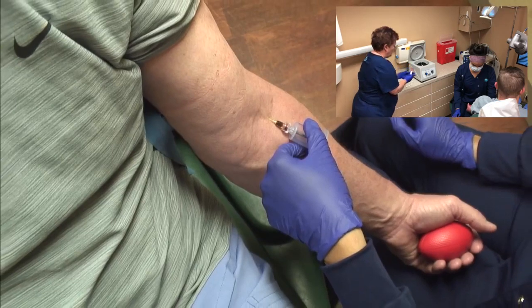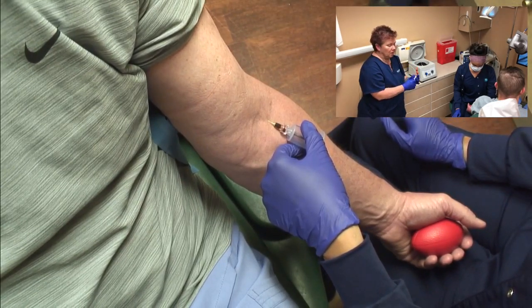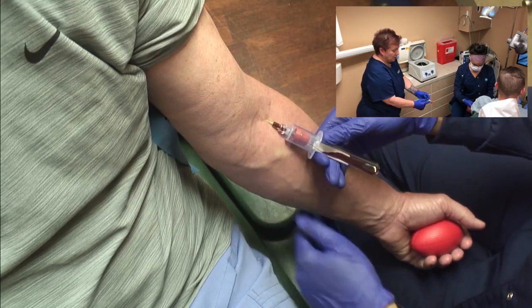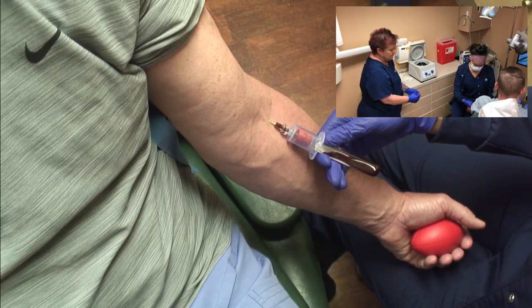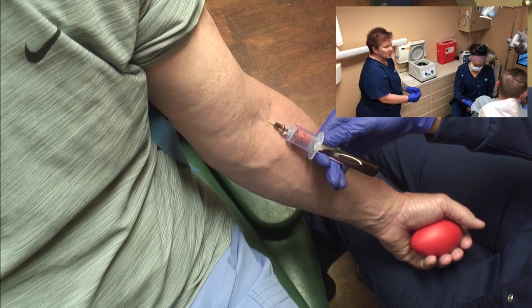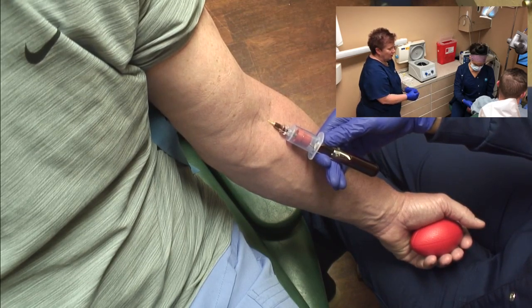Now, these have to get into the centrifuge immediately. These are the PRF tubes. I'm going to hand her one of these first. You want to hand it with the label down so that they can see the blood filling the tube. And sometimes this can take a long time, especially if your patient is sedated. And if you have a vein like we have here, it's going pretty quick.